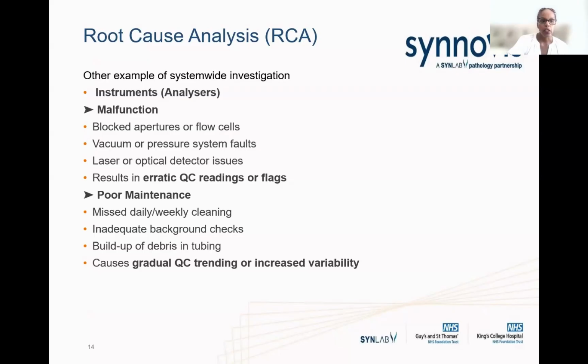Other bits are just a malfunction of the instrument itself. This is just because I worked in hematology, but examples within hematology are blocked apertures or flow cells. Vacuum issues used to be quite a big one. Laser optical detection issues. All of those can interfere with your readings, as can poor maintenance of the instrument. If your instrument doesn't have its yearly maintenance, or it's missed its daily or weekly cleaning, that can build up debris and impact your QC over time.